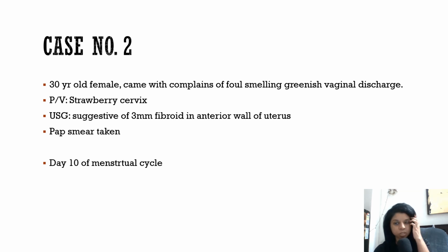And then the pap smear was taken on day 10. Day 10 means it is the proliferative phase of the menstrual cycle. So greenish vaginal discharge and strawberry cervix.